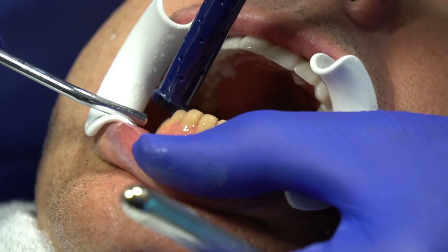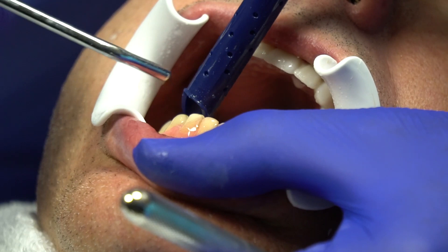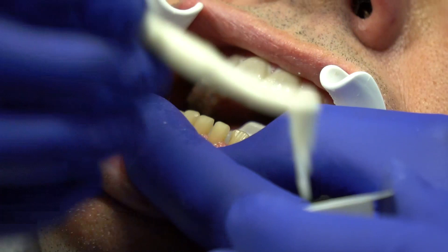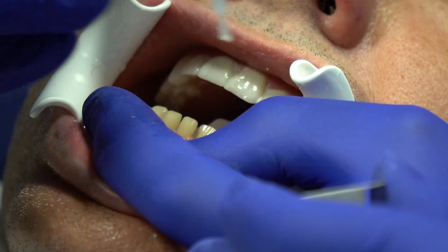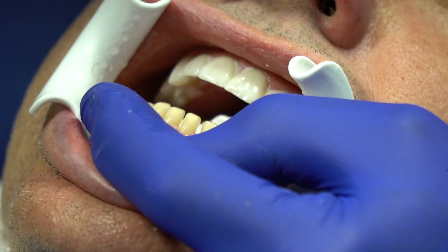We rinse with a copious water lavage. Now we go to Tenure A and B again — I'm looking for frosted enamel everywhere. Don't try to use a micro brush with this Tenure A and B because you won't carry enough volume of liquid to the tooth. With a micro brush, you'd need to go back and forth 18 times to get the same volume I get in two goes. Then come back from a distance or use a saliva ejector to gently evaporate, then go right to the Tenure S.